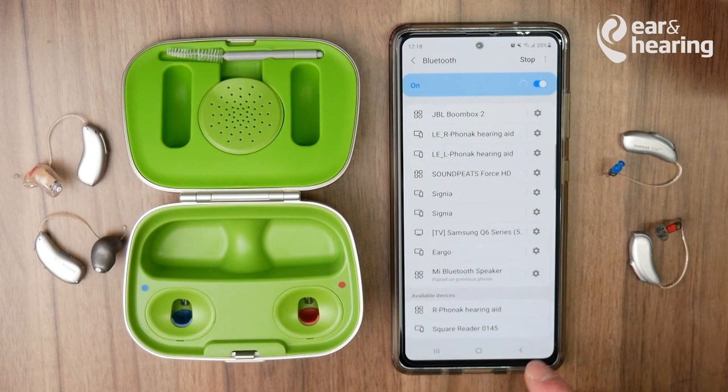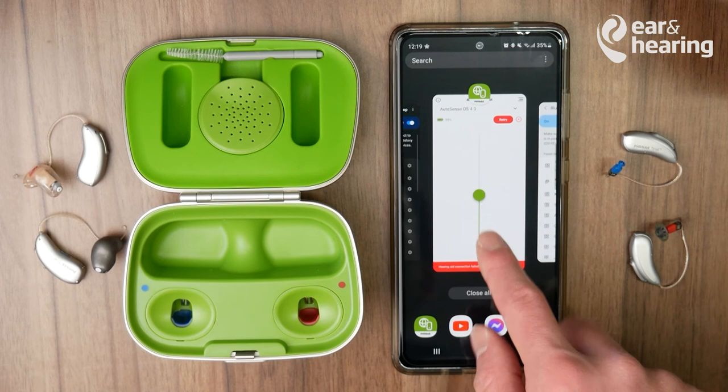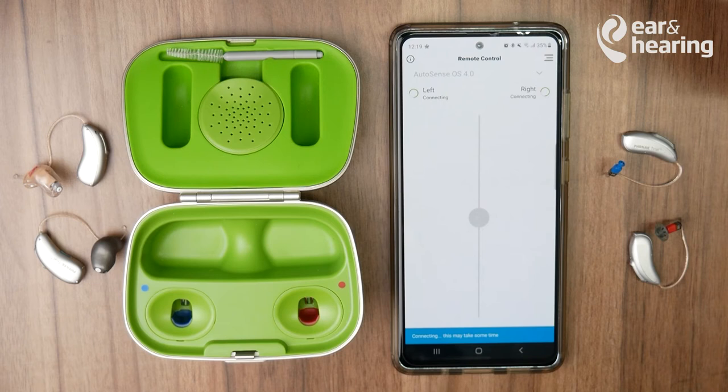You can scan one more time and scroll down to the bottom. You should see that the right Phonak hearing aid is now available for pairing — remember to press Pair. If you're in the app and it still hasn't connected, you can press Retry.